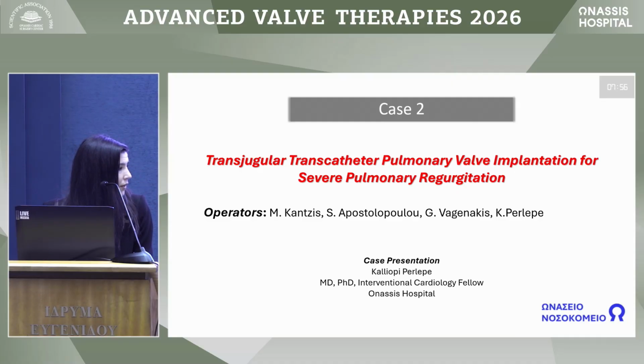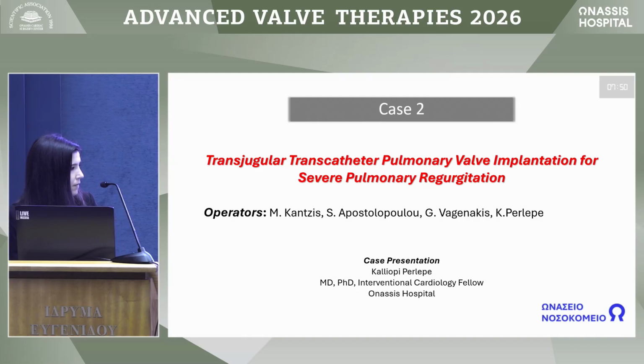Hold on a second, just to clarify. So in this first case, what was the size and the type of the valve? I missed that, of the original valve.